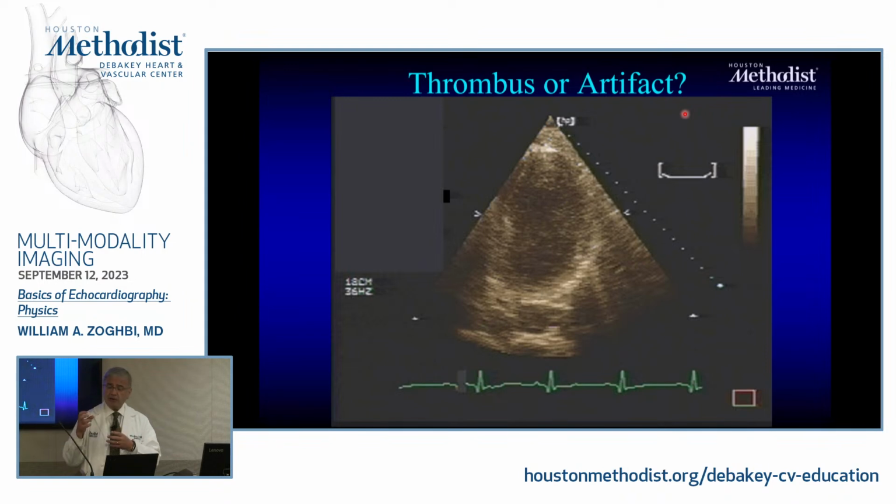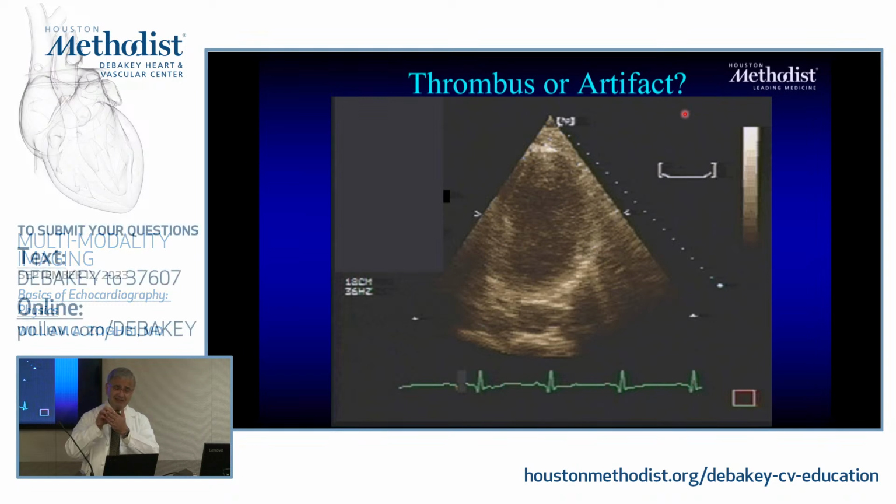Okay, how do I make the image? Remember, there are these tiny crystals. There is a casing that closes it, and that's why you're not seeing everything. Then there is the chest wall. Then there is some fat could be, right? Little muscle. And then you have the epicardium and all that.